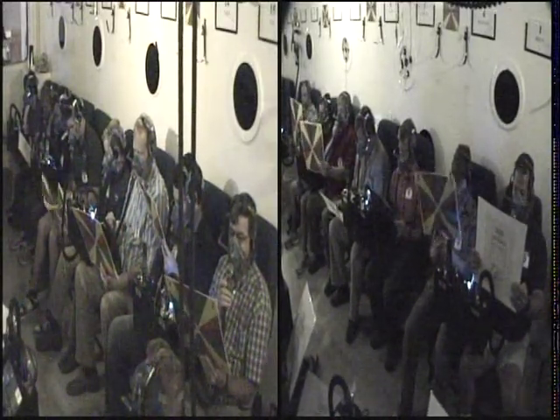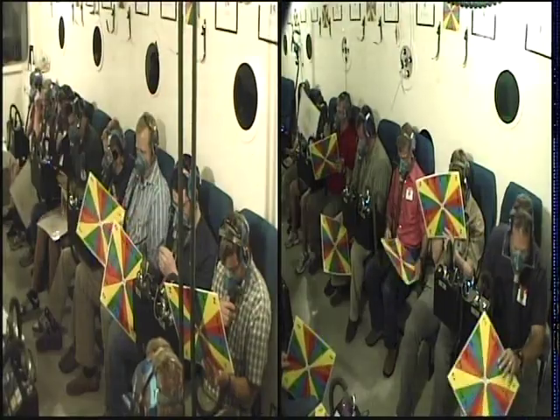The visual acuity test. Can you make out a line further down than you were previously? And then also, look at those icons. Can you make those out any more easily than you were previously? If you haven't noticed any improvement by now, you're probably not going to. So focus your attention towards the floor. The lights are coming up. And then pass those cards back down towards JR.